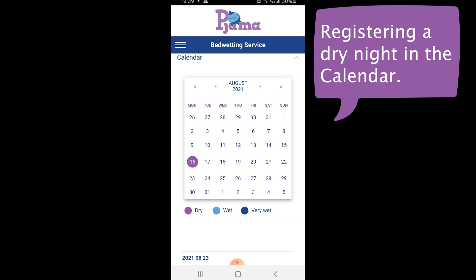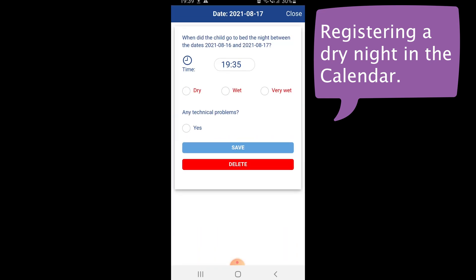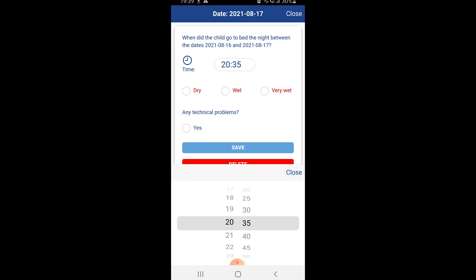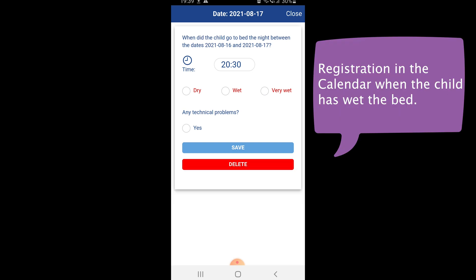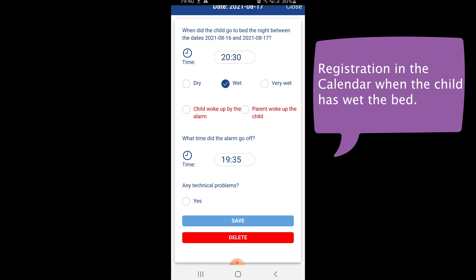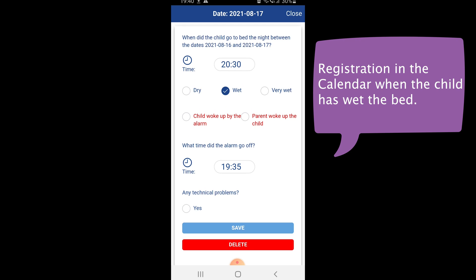In a similar way, a wet night is registered in the calendar between the 16th and the 17th. Again, the time when the child went to bed is entered in the calendar — say 8:30. We select wet, indicating that the child wet the bed during the night. The next question is whether the child woke up by itself by the alarm, or if the parent had to wake up the child when the alarm sounded.